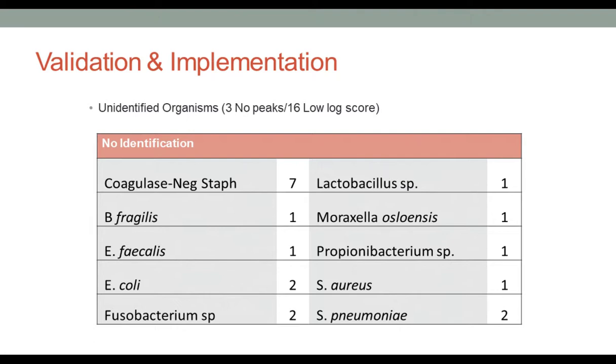Did you face any resistance among the physicians regarding providing an ID without the susceptibility results? Well, we are providing a susceptibility result, but it's in the normal time frame that they get the results. Actually, our physicians were the ones who drove a lot of the interest in this. The Antibiotic Stewardship Committee was looking at ways to decrease or to change the antibiotics to make sure the patient gets on the appropriate antibiotics more quickly. And so they were all for this. They were really interested in us coming up with some method to get a rapid identification.